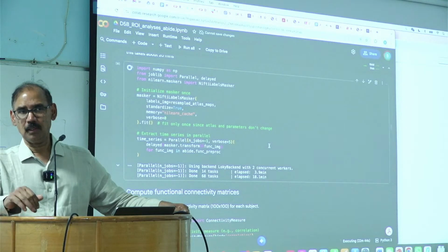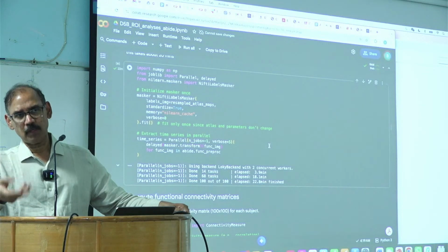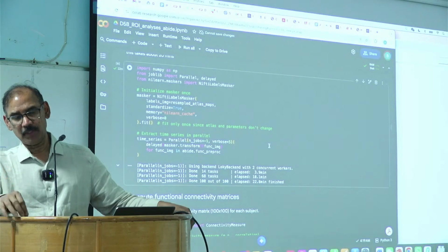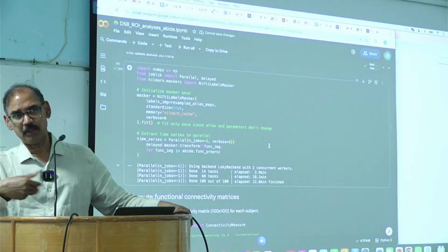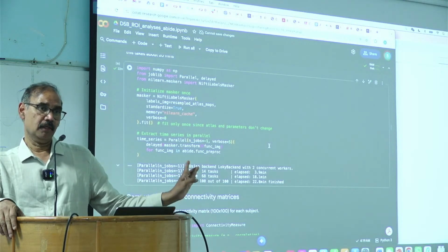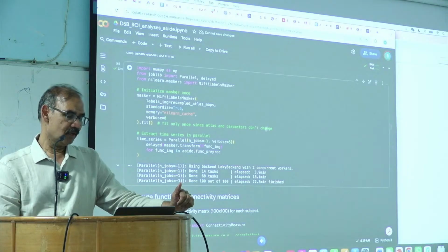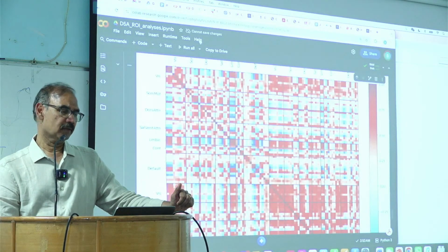That is fine. So if you're going to focus on just one network, the other thing that you can do is not take an ROI, but take all the voxels and do the analysis. Either one, right? You could use something like this one, right?